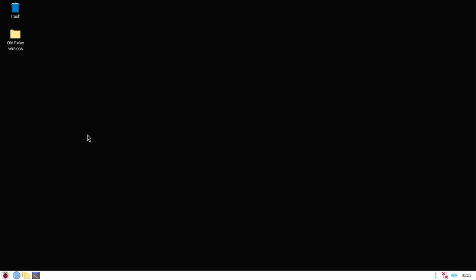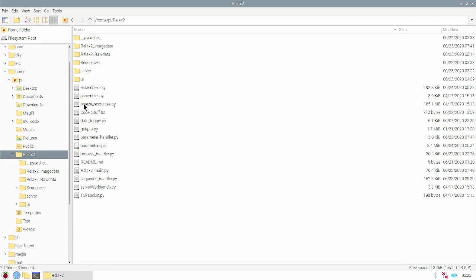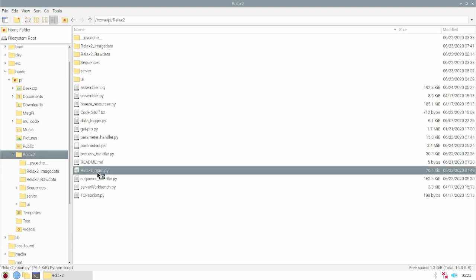In this second video I want to show you a live demonstration for the tabletop. For this I open the file manager and go to the relax2 folder where I open the relax2 main python file.